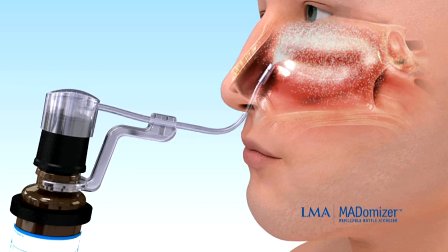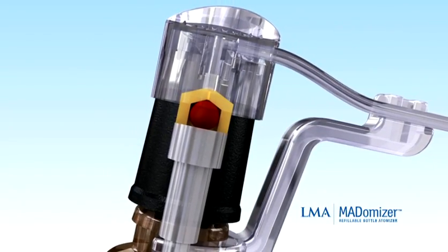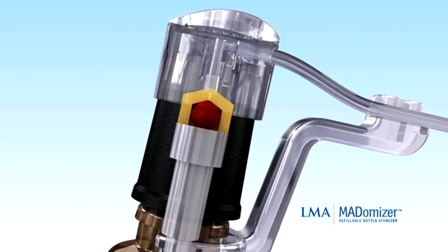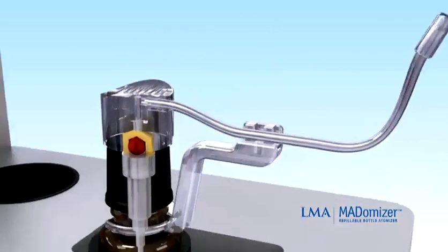Each pump delivers exactly 0.1 milliliter of drug as a fine atomized mist of approximately 30 to 50 microns. There are 200 pumps per full bottle. The unique one-way check valve ensures unidirectional flow, preventing any risk of internal device contamination.